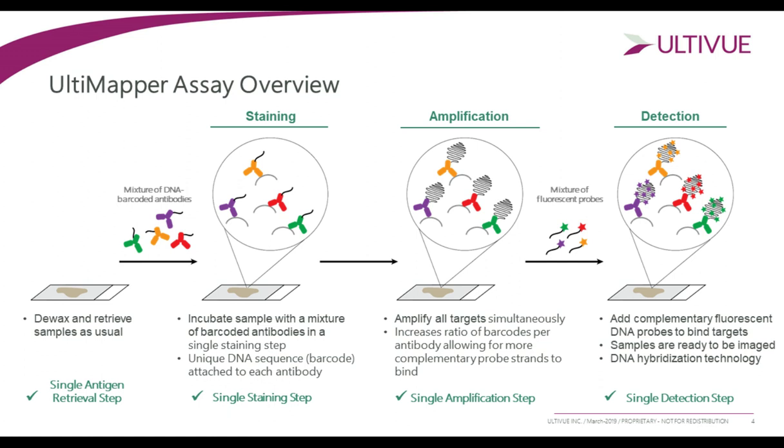a single amplification step. Now, this single amplification step of all targets is incredibly important. This amplification step is a linear amplification method, and all targets are amplified at the same rate and at the same time. And why is this important?